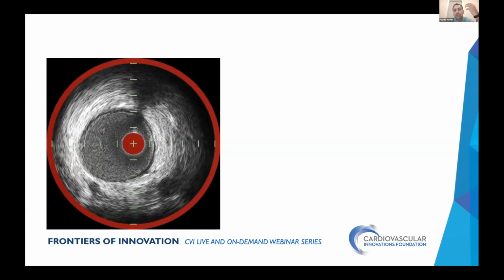I couldn't even justify to the patient that I'll bring you and desensitize you in the CCU, because he was like, do you really think I need a stent? Because my CT told me it's a moderate lesion. It's a single vessel CAD. Why not just do something? And we debated this for a long time before I even put him on the table. I'm showing you the last step of many visits, but this is what we ended up doing. I had to convince him step after step, present him with data that this is vulnerable plaque, physiologically positive, for him to go through the desensitization and accept a stent for a single vessel CAD.